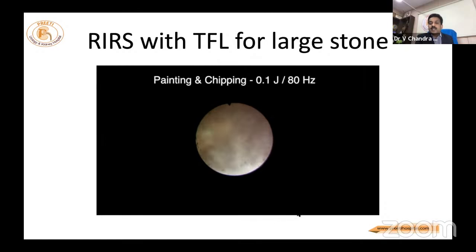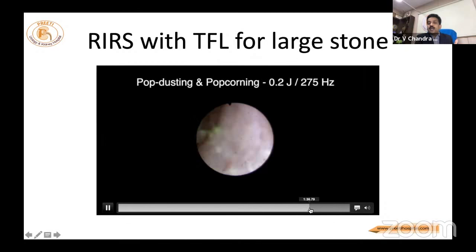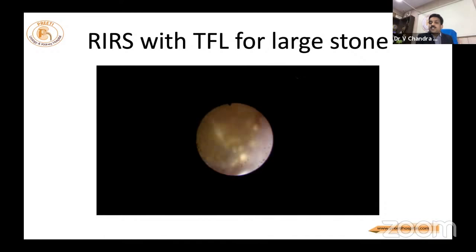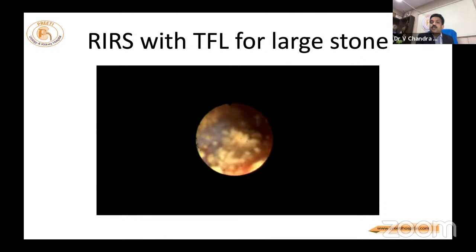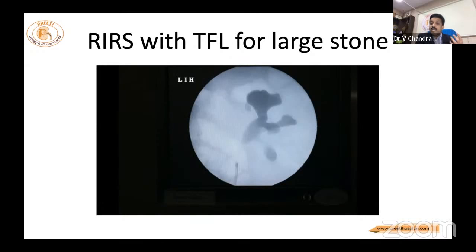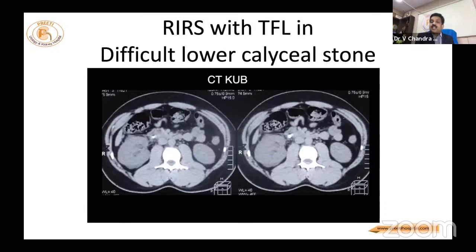For example, at the end of around 10 minutes, 20 minutes, if you can do in the upper calyx like this, see, this is the dust at the end we produced. But the only problem is vision, temperature, and continuous outflow. If the stent is not done before, if a 12/14 French sheath is not used, you may injure the mucosa. Only studies will prove that.